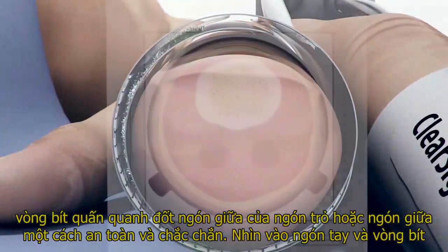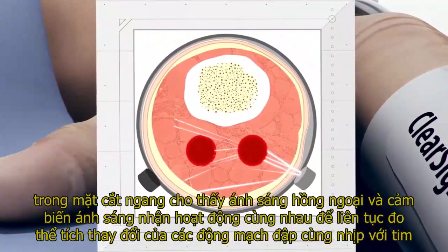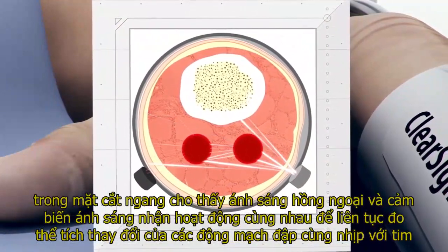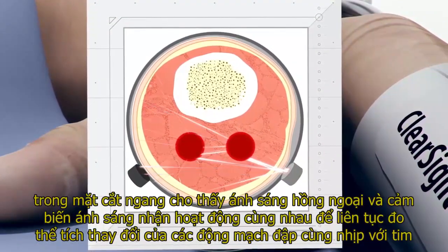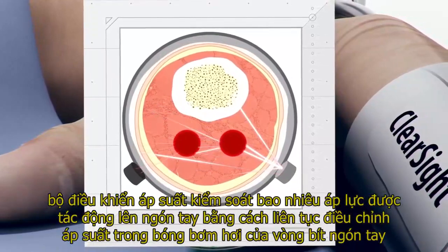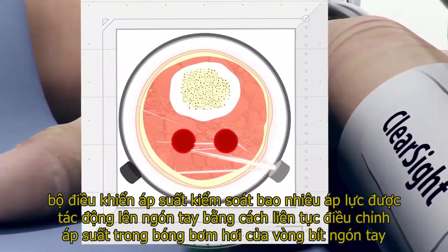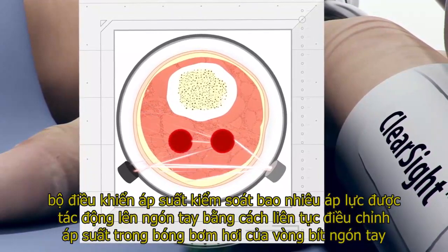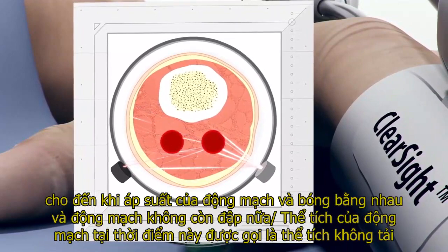Looking at the finger and cuff in cross-section shows that the infrared light and receiving light sensor work together to continually measure the changing volume of the arteries, which pulsate at the same rhythm as the heart. The pressure controller manages how much pressure is exerted on the finger by continually adjusting the pressure in the finger cuff's inflatable bladder until the arteries and bladder are equal in pressure and the arteries no longer pulsate.